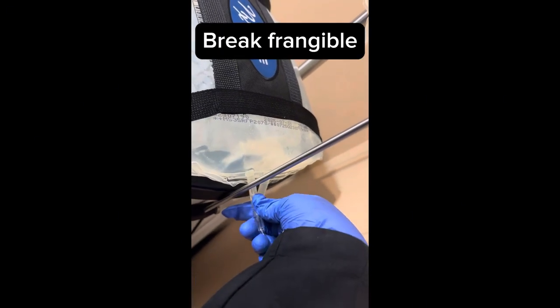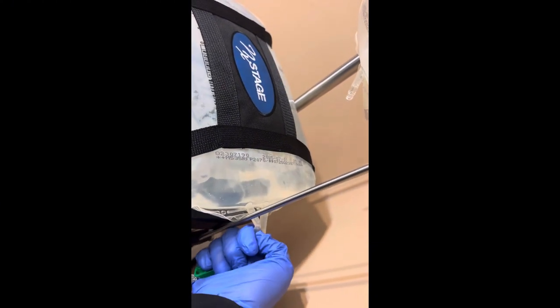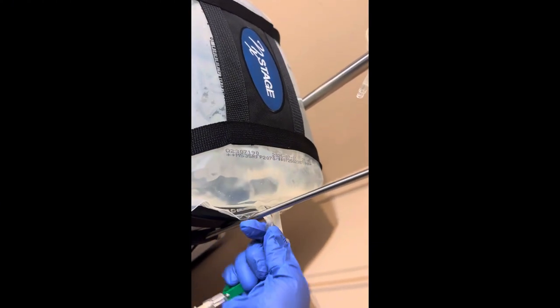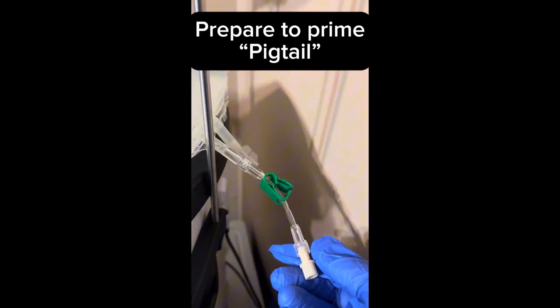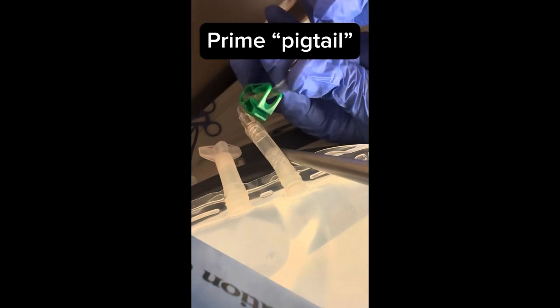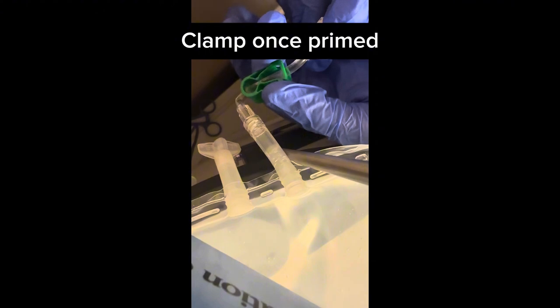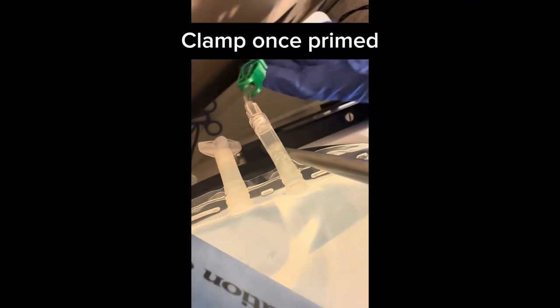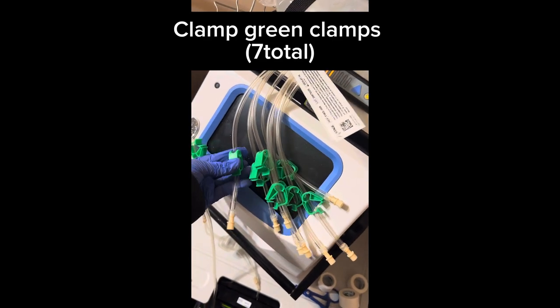Break the frangible. Prepare to prime the pigtail, then prime the pigtail. Once primed, clamp. Find the rest of the MLA lines and clamp the green clamps — seven total.